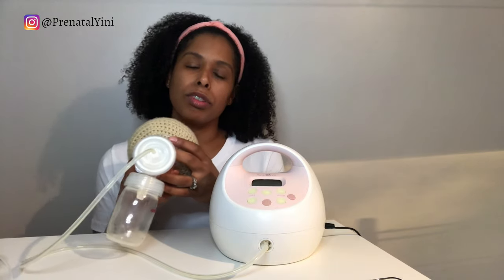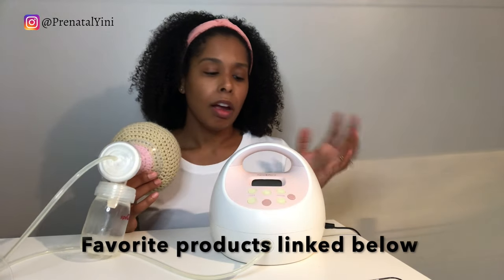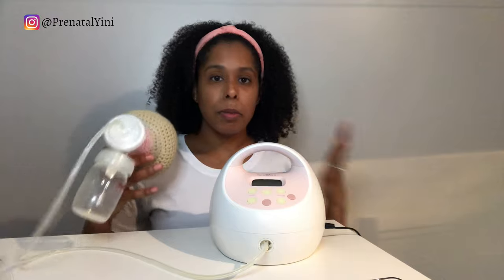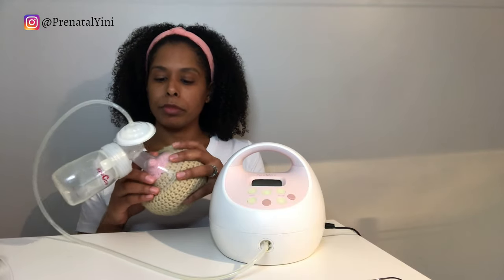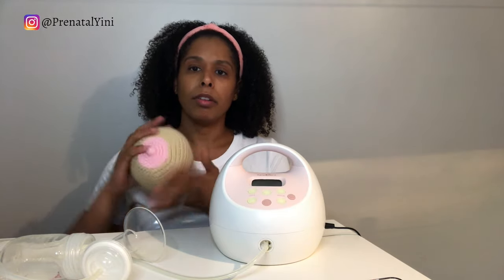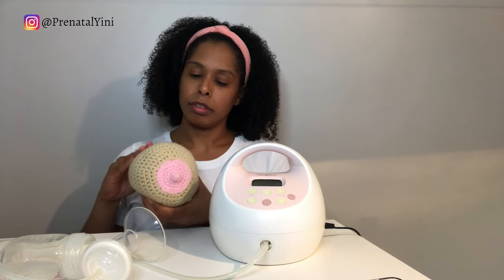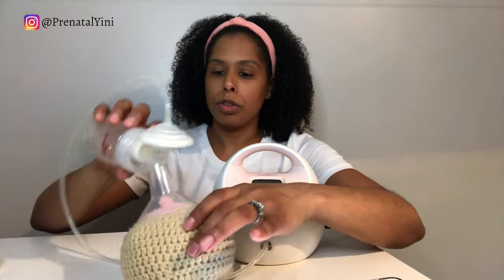I always recommend using a pumping bra — it makes life much easier. You can get a hands-free pumping bra or make your own. Also, before you start pumping, massage your breasts: side to side, up and down, and in circular motions for about 30 to 60 seconds.